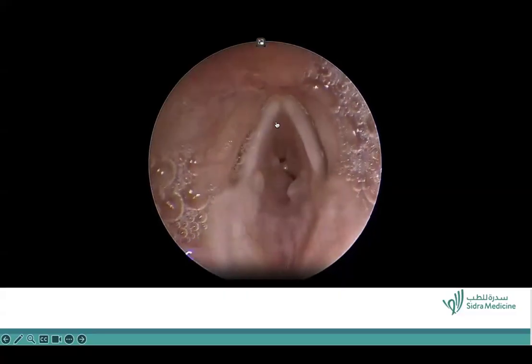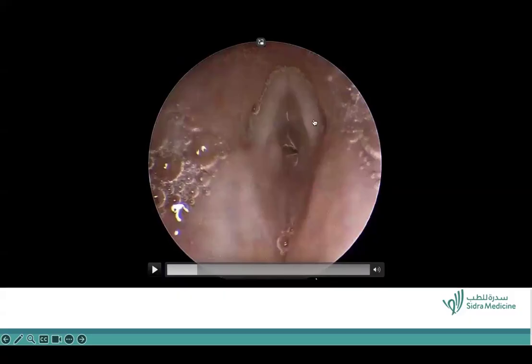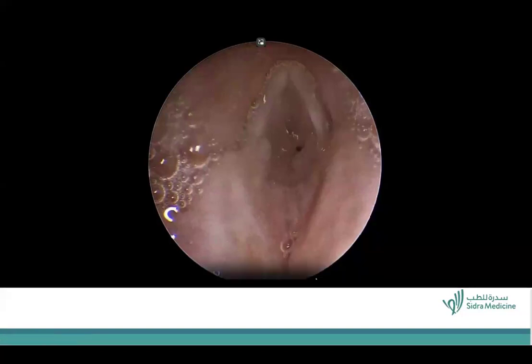Okay, good. So I see Ruqayya Al-Mari mentioned subglottic stenosis. So yes, absolutely. There's stenosis in the subglottic area for sure. So you can see that there's almost basically no airway, right? Like there's edema and narrowing and stenosis. So these are the vocal cords, and immediately below that, there's almost no airway. And as a background, in terms of history, this patient came in at like 10 p.m. at night to the emergency department in severe distress. So this needed to be done more emergently.